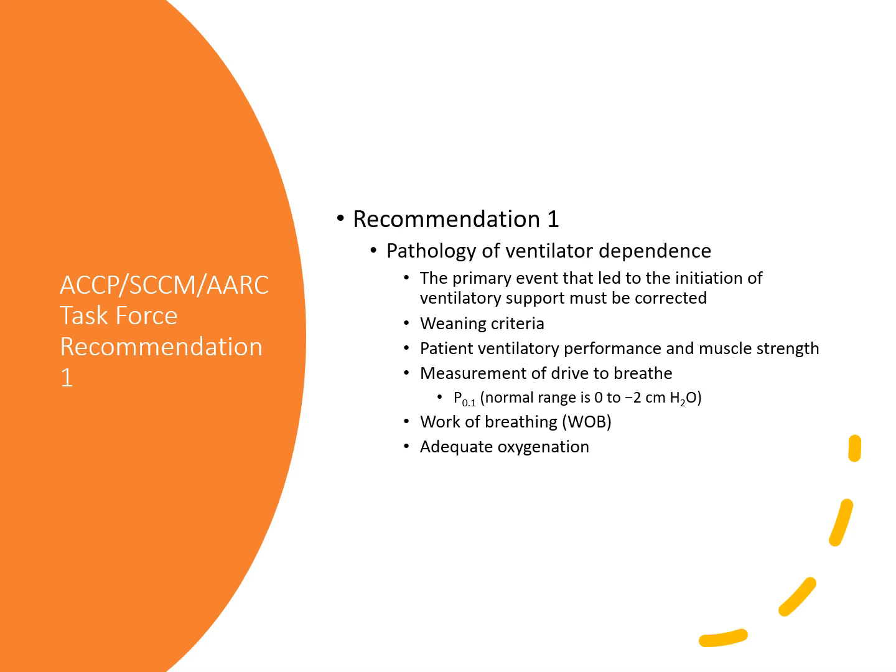Some patients might be healthy enough to wean, but not necessarily healthy enough to extubate. So you have to pay attention, you have to be part of that care team and do your full assessment here. When a patient's medical condition is stable and the patient is breathing spontaneously, alert, and cooperative, then you can look at the gas exchange values and see if they're really ready to wean.